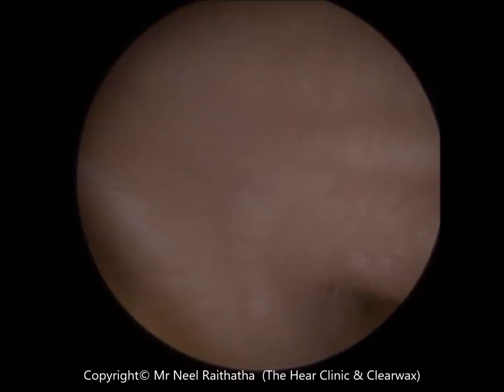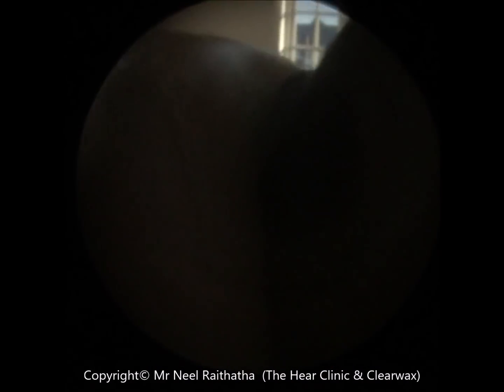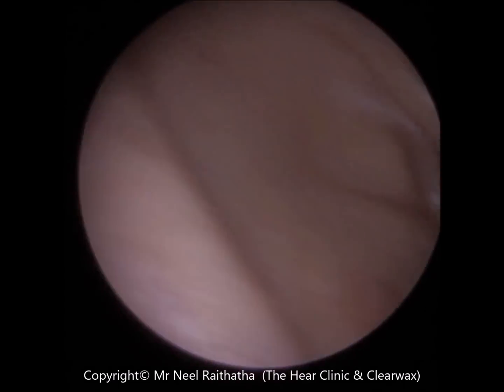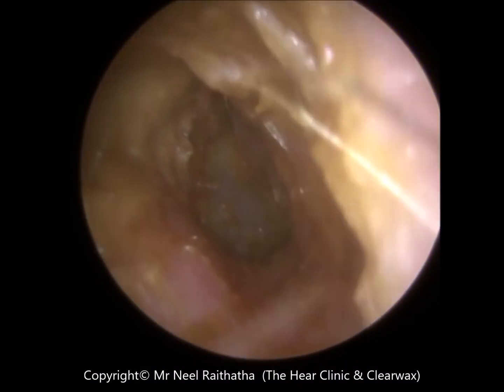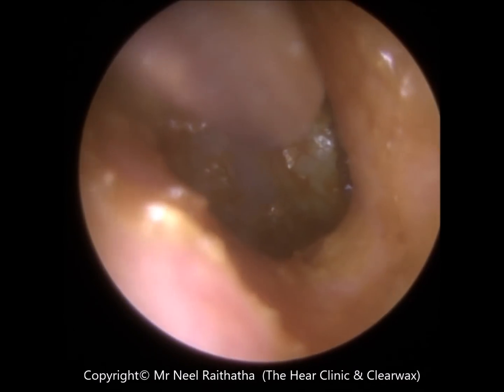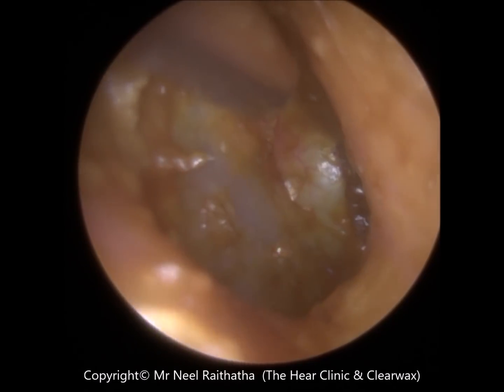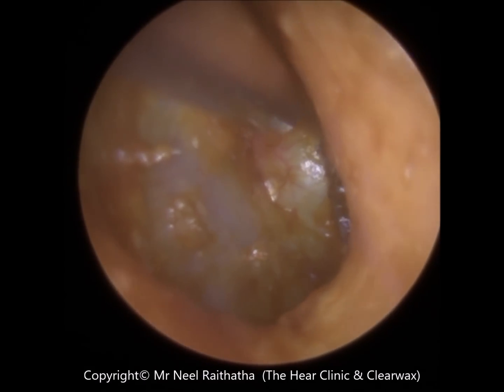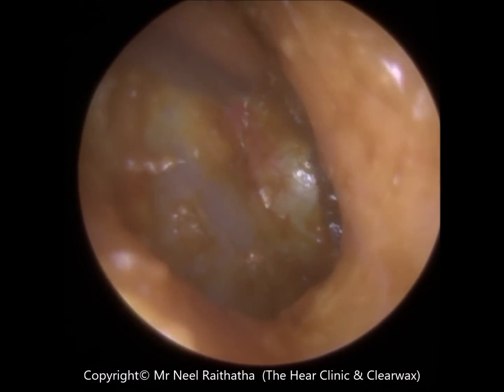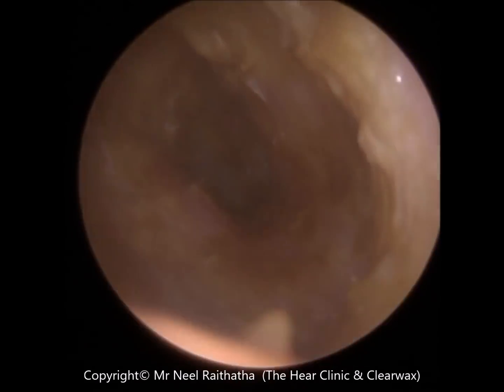I've got most of the wax off the eardrum. There is some left in a part of the eardrum called the anterior recess, which looks like a little valley — a little hideaway spot near the eardrum on the right-hand side where wax can settle — and it's very difficult to get access to. With a microscope you may not be able to visualise that, but with an endoscope you can. It's adjacent to the ear canal wall which is very sensitive. How are you feeling now?